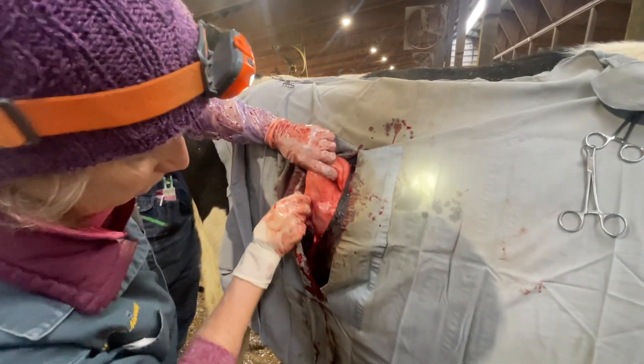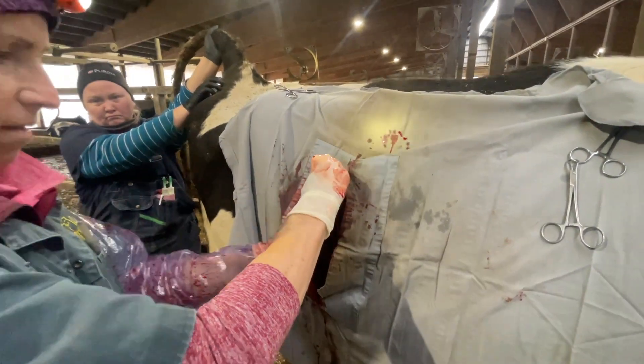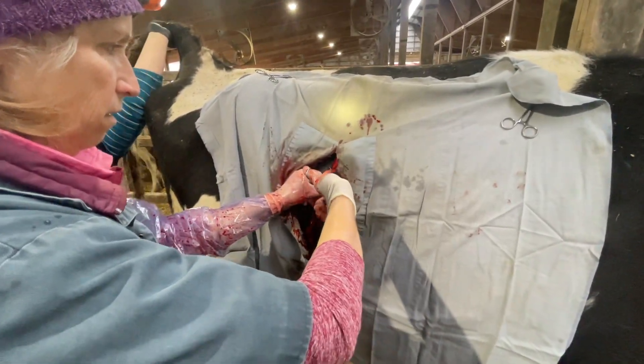So when you sew her up, you're going to stitch the abomasum to the outside wall of the cow — to the muscle layers — so that it's not going to move again. Right now I'm just going to hold this right here so it stays.